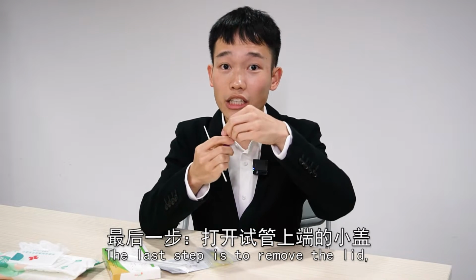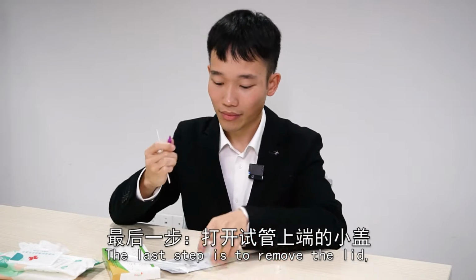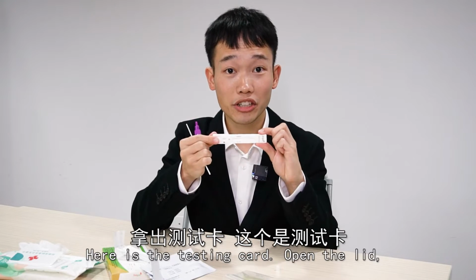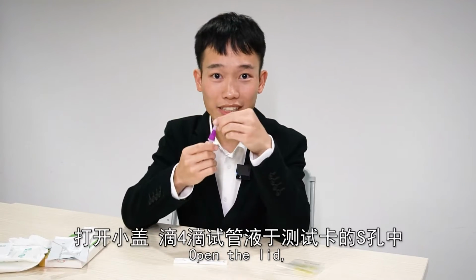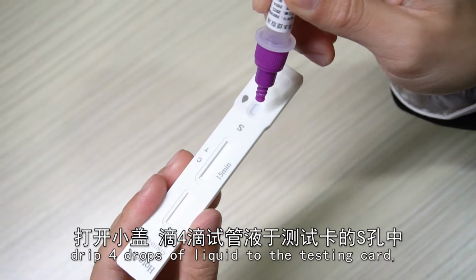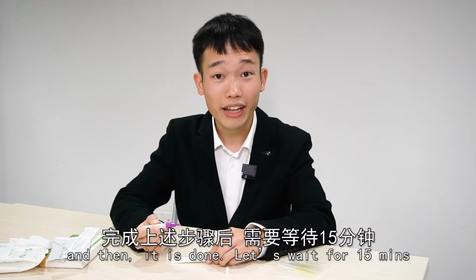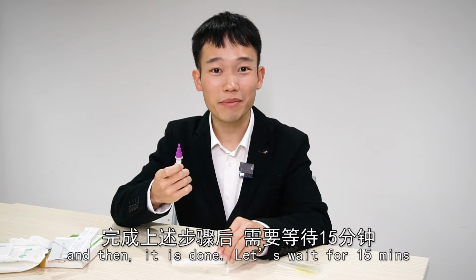The last step is to remove the lid. Then find your testing card. Here is the testing card. Open the lid and then drip 4 drops of liquid to the testing card. And then it's done. Let's wait for 15 minutes.